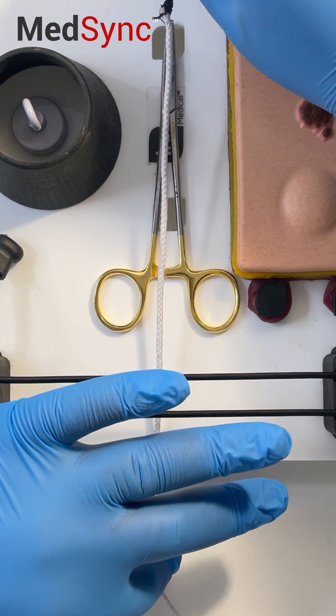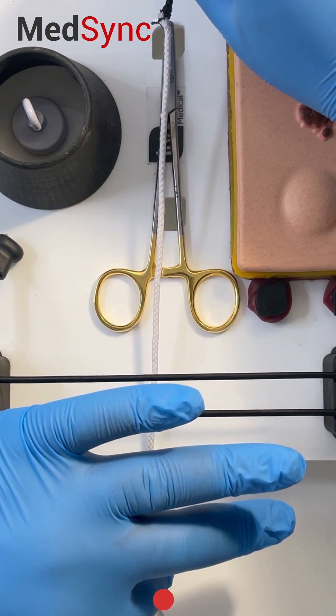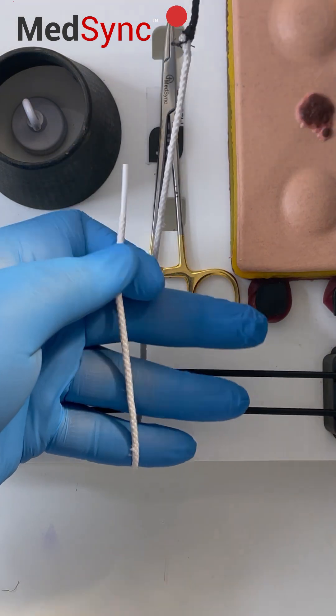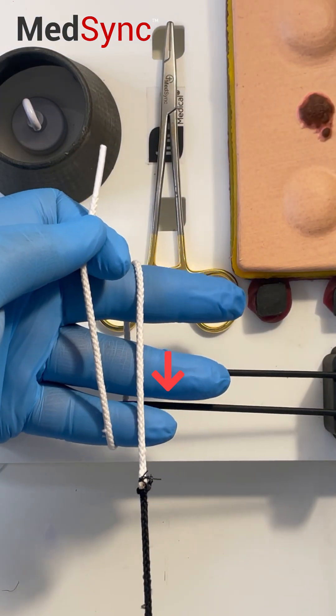You pick up the short end between thumb and index, turn your hand over. Lay the long end parallel to the short.